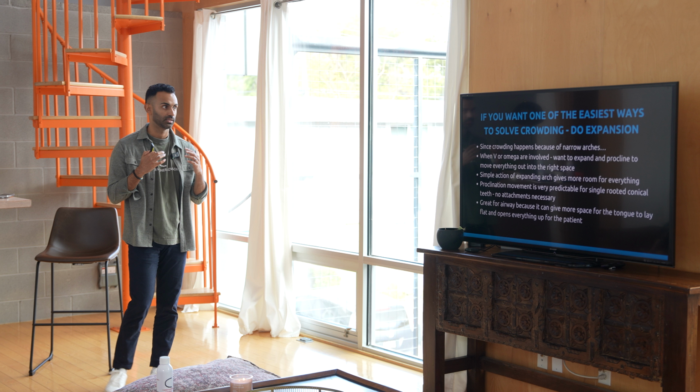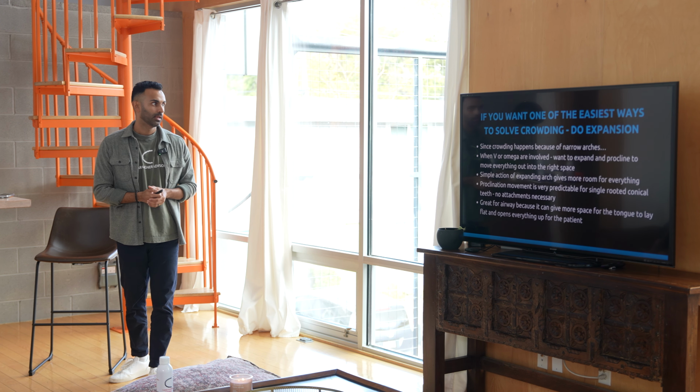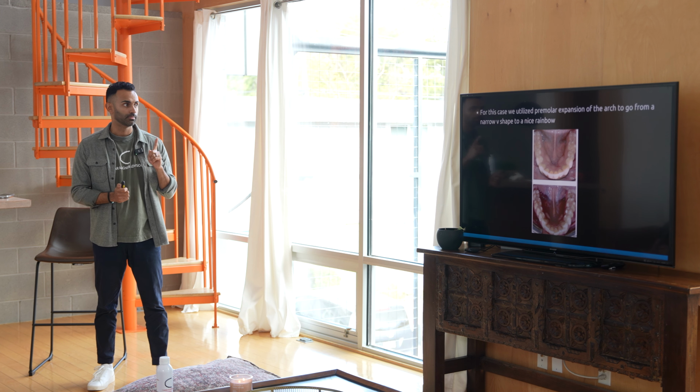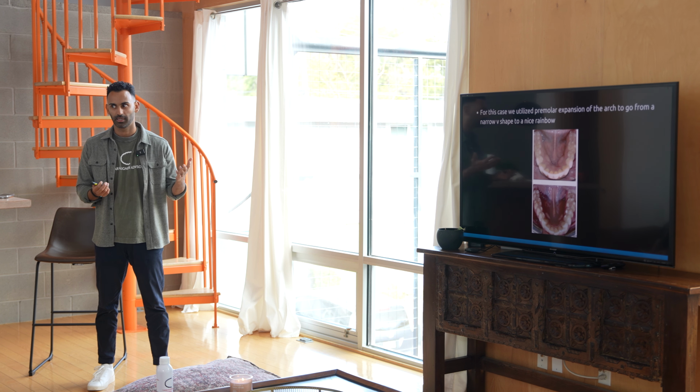So a lot of dentists, when they see crowding, they want to hit expansion, and they just want to open everything up. And for this case, we did that, but we did premolar expansion. Okay, there was molar expansion that was planned, but it actually didn't express. And so you may be thinking, well, if it was planned, why didn't it work?